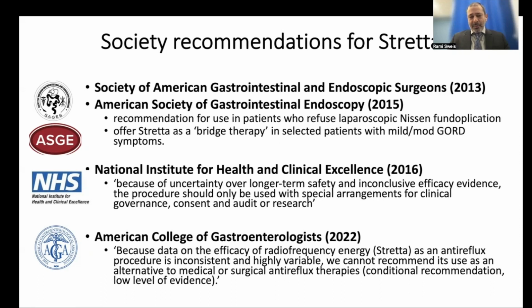So I think that's a bit harsh. I think there might be a role for Stretta for those, especially with a positive reflux symptom association, if we're aiming to neuromodulate. But as a primary intervention to reduce reflux in itself, it's not clear.